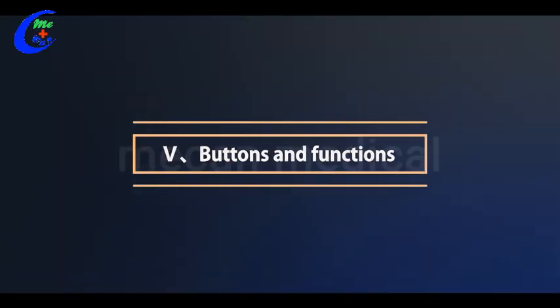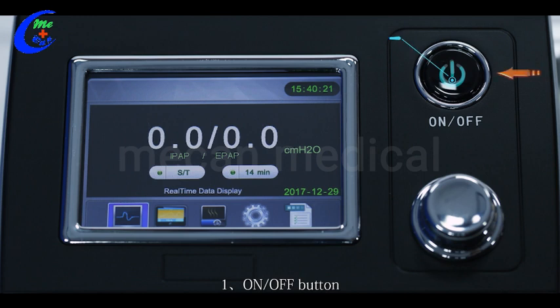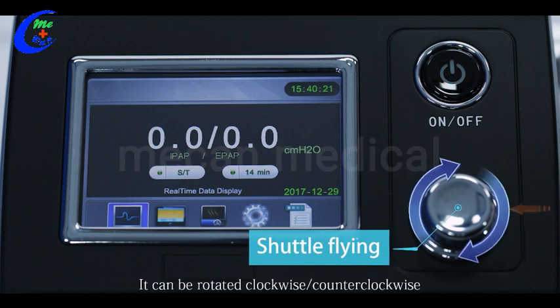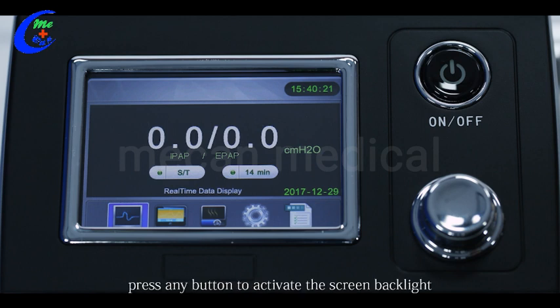Five, buttons and functions. There are two buttons on the host available for operation. One is the on/off button — after connecting with the power supply, the indicator light will be on. Two is the shuttle dial, which can be rotated clockwise or counterclockwise to adjust the parameters. Press the shuttle dial to confirm. When the screen backlight is off, press any button to activate the screen backlight.